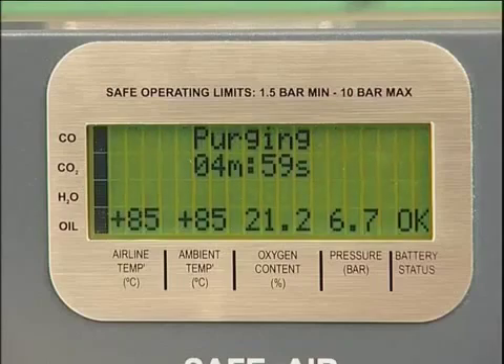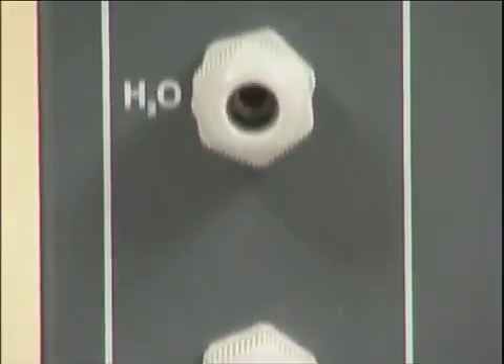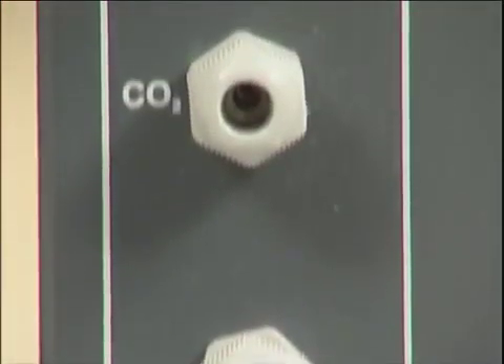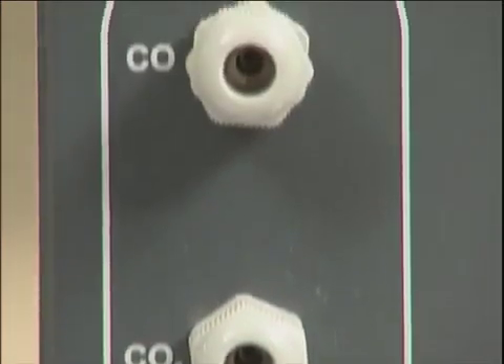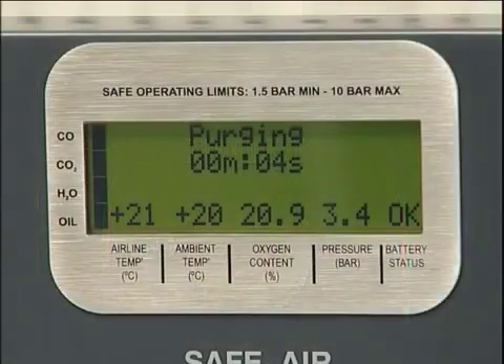The unit will now commence a five minute purge sequence, during which time airflow will be passed through all four tube ports. This clears contaminants from previous tests and ensures that a representative sample is being tested. Once the purge has finished, the Draeger tubes can be prepared for insertion.